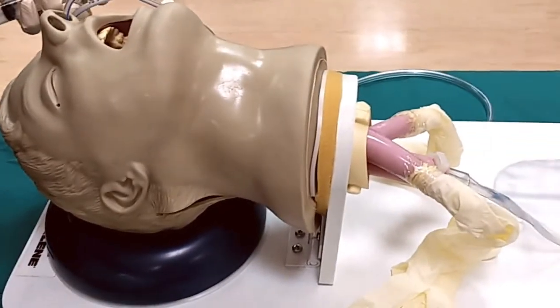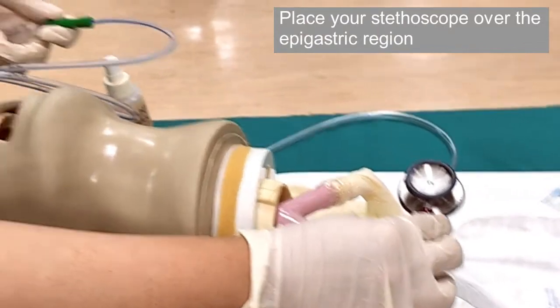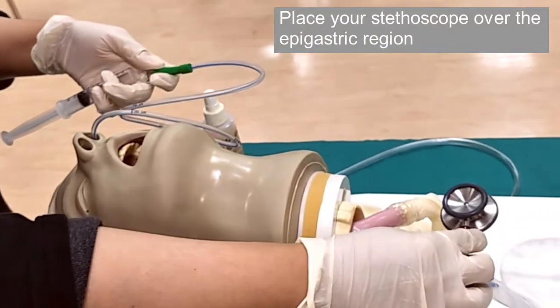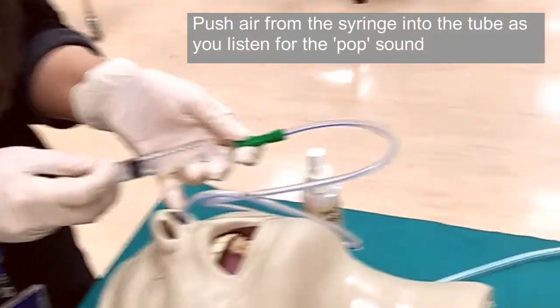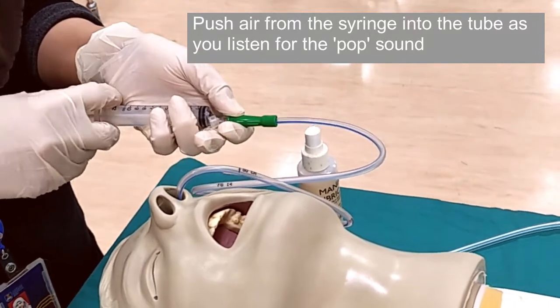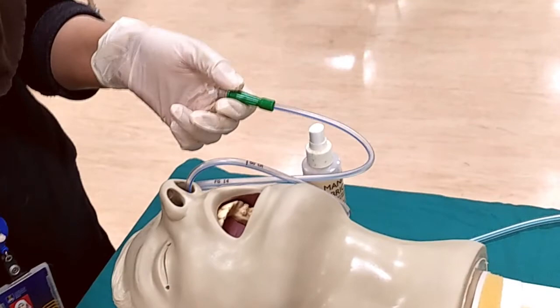Then place your stethoscope diaphragm at the gastric area — the stomach region in a real patient. Once done, push the air from the syringe into the tube rapidly as you listen through your stethoscope. If the tube is placed correctly, you should be able to hear a pop as the gush of air goes through the tube into the stomach.